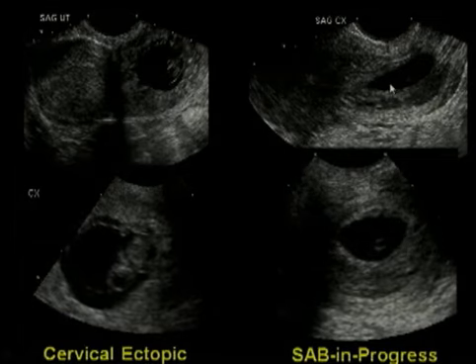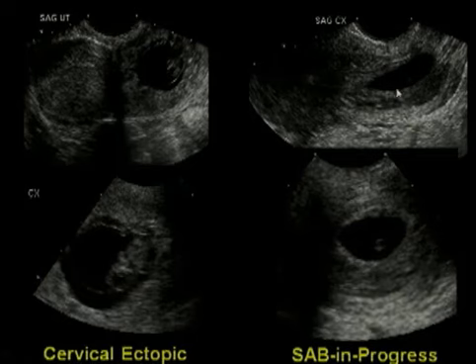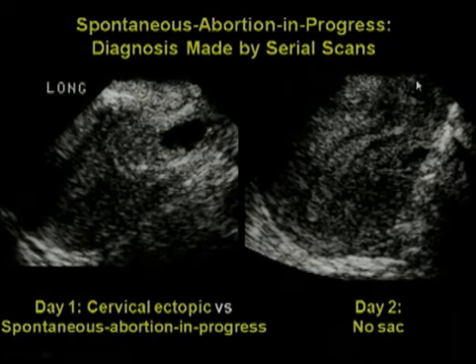Here, on the other hand, we see another transvaginal view, nothing in the body of the uterus, a flattened sac in the cervix. There's not a bright rim around it. We see a little yolk sac, but no embryo. This is a spontaneous abortion in progress.